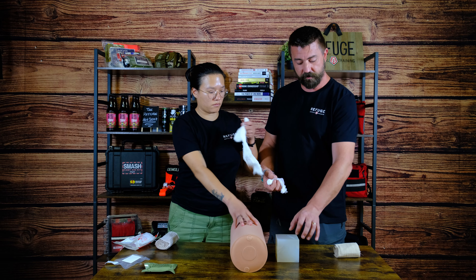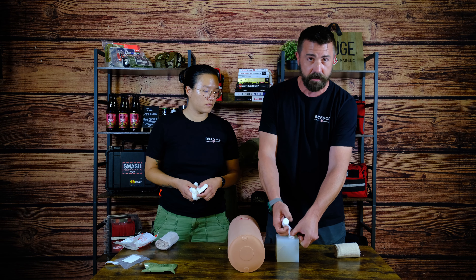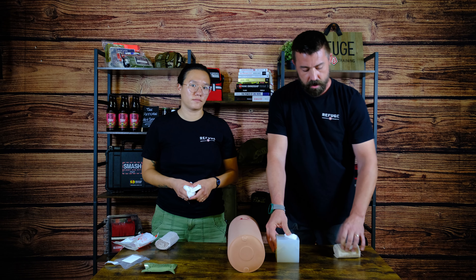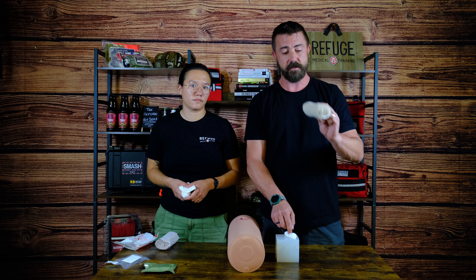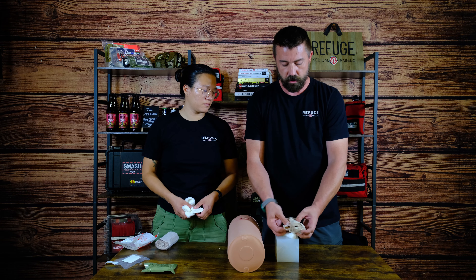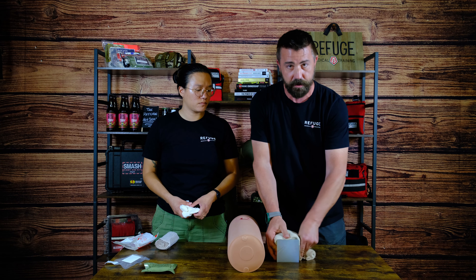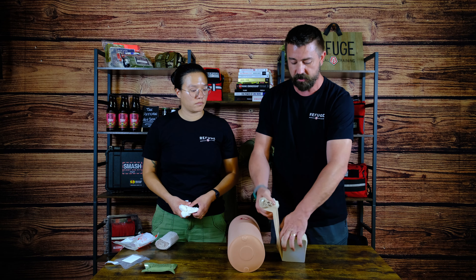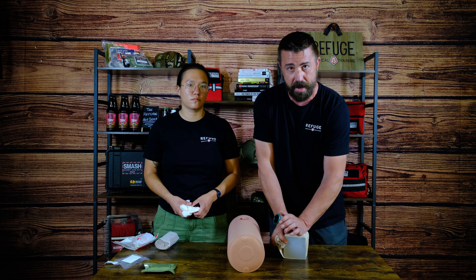That being said, if you're trying to pack a wound that's a gouge like this, like a chainsaw injury, you could take the time to feed it in there, or you can just take a smaller roll and stuff all of that in there. This is an ETD, Emergency Trauma Dressing — these come in different sizes. This is a smaller four-inch ETD, which is common in smaller compact kits. I would take this, apply the bandage over that, and wrap it all the way around, maintaining pressure as I do. This allows me to keep pressure on the wound without having my hands tied up to maintain manual pressure.